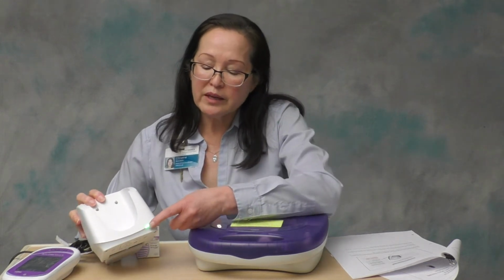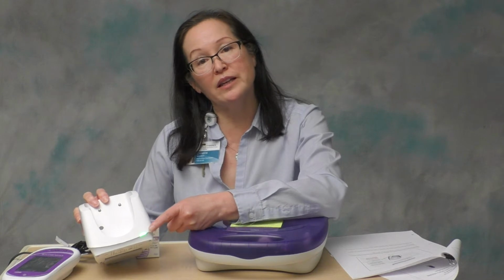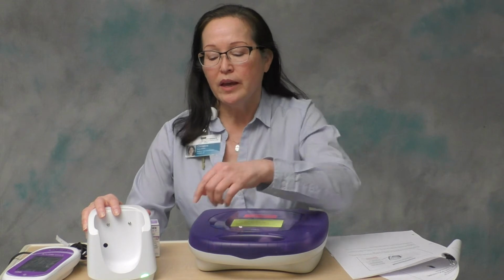There is a light down here in the lower right hand corner that should always be on if the base is plugged in correctly. That indicates that there's power and it can recharge the meter. If the light is green, it indicates that it is connected correctly to the network and your data is being transmitted. If the light is red, either solid red or blinking red, it indicates that there is some issue with the data transmission.